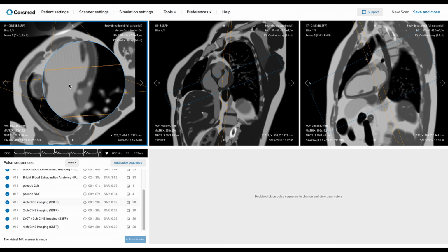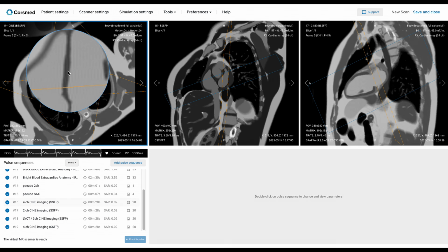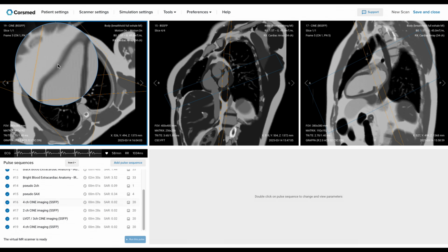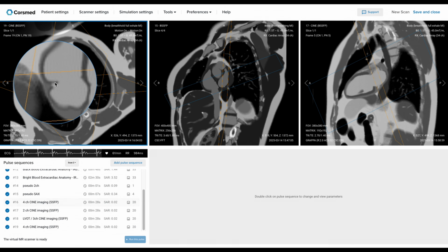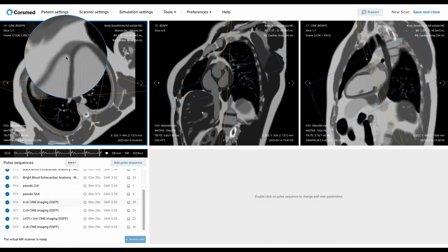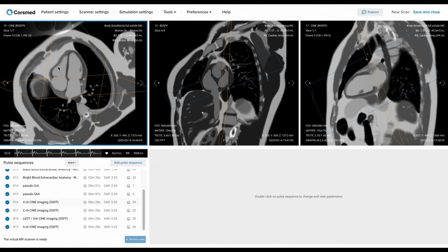When it comes to the right ventricle, the myocardium is naturally thinner. We're mainly focused on getting clear images of the endocardium. That's the key requirement. We do look at the epicardium too, but it's more relevant in rare cases, like non-compaction of the right or left ventricle. So these are some of the situations that might lead us to repeat a scan.